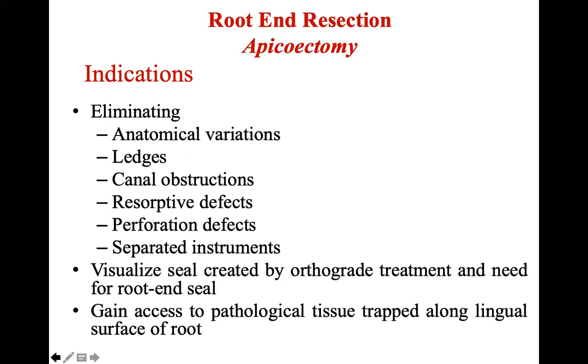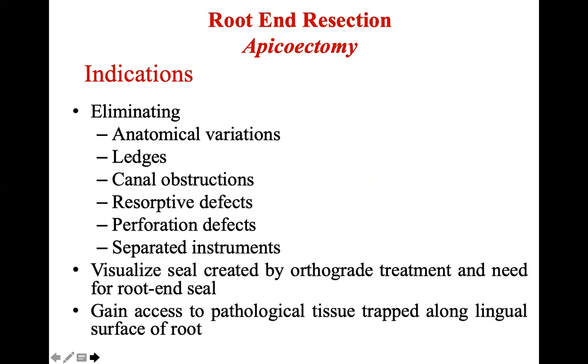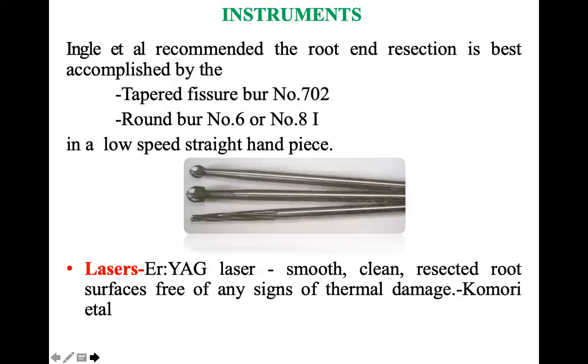If you go back to the earlier picture, see this is the lingual side of the root. So if you want to even take a biopsy, unless you cut this part of the root, you cannot reach this part, isn't it? If this lesion was big enough, then unless I remove a part of this, I will not be able to clean the lingual side of the tooth. So these are the common indications for apicectomy.